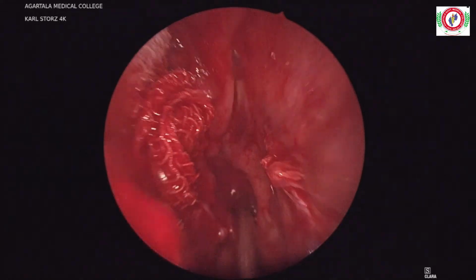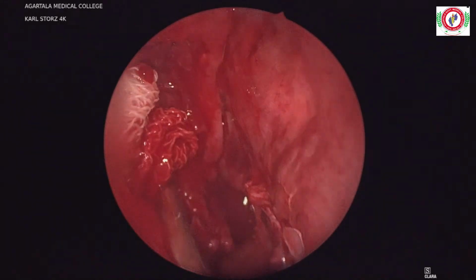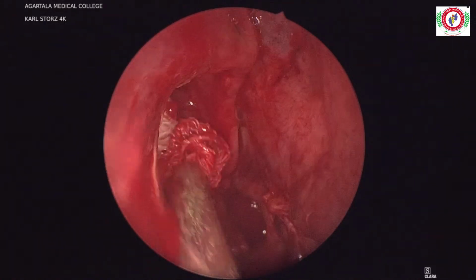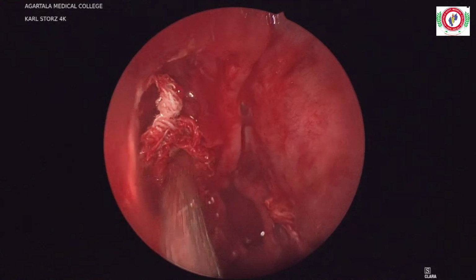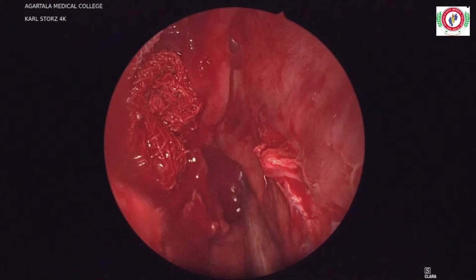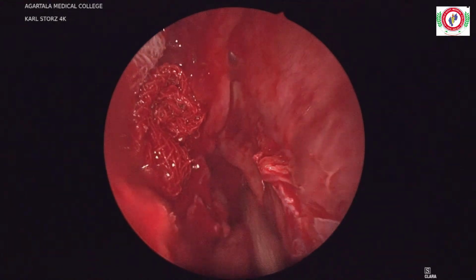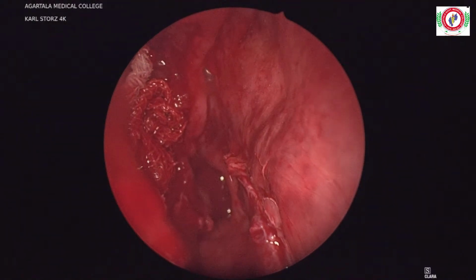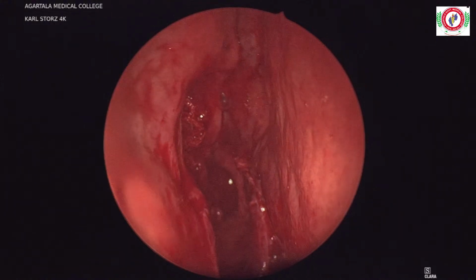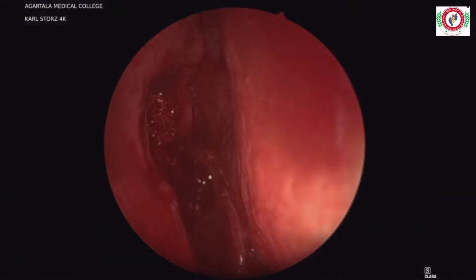If it is a very well defined bleeder, okay, you can use a monopolar cautery, like you can use this here if it is a big bleeder from the sphenopalatine artery. But if this is a diffuse ooze, I would not recommend anybody to use a monopolar cautery because it will char whole of the mucosa here.